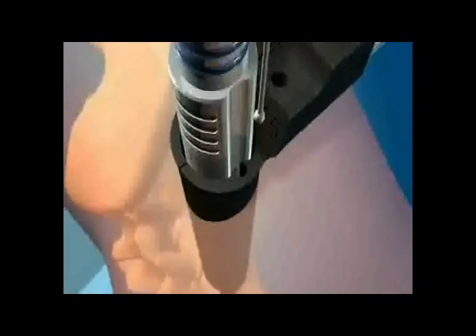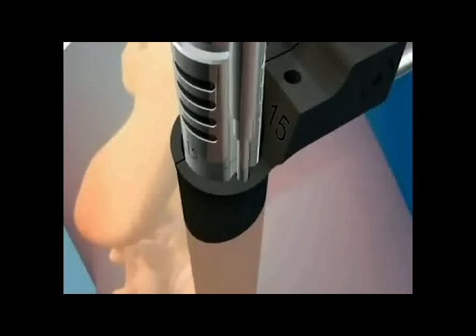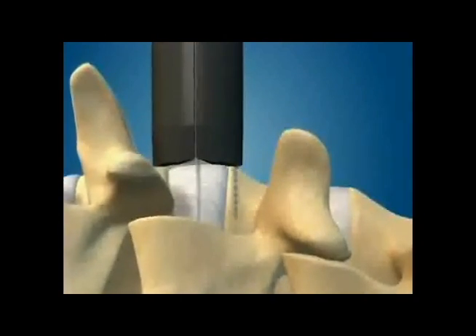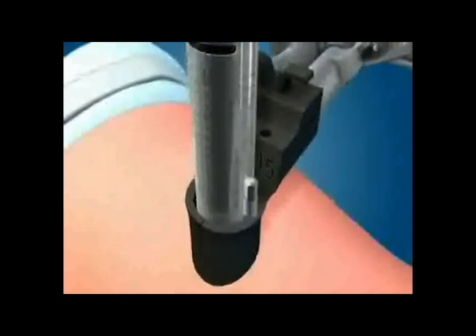This allows for the placement of a viewing port, which is inserted over the dilators and directly down to the spine. Spinal monitoring is used again to make sure there are no nerves in the field. A holding pin is placed in the bone to keep the viewing port in place during the procedure.